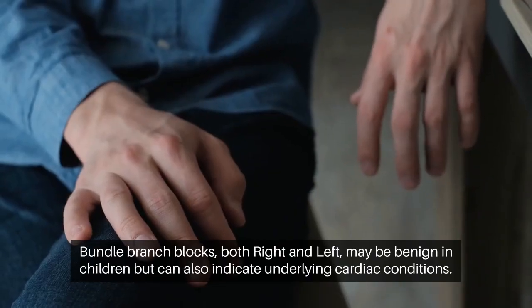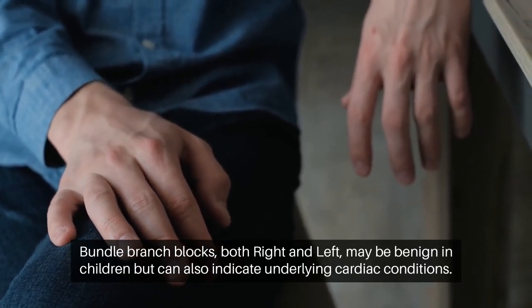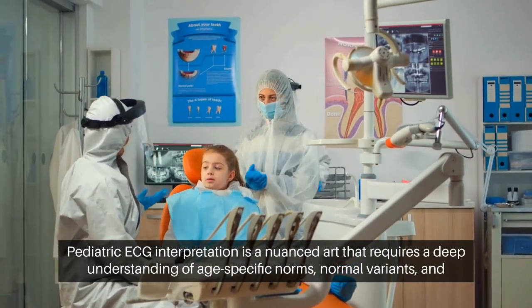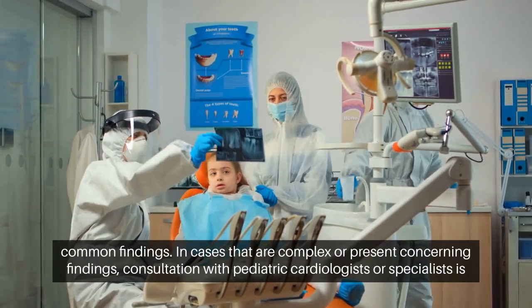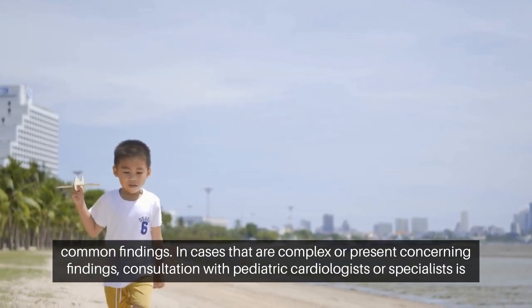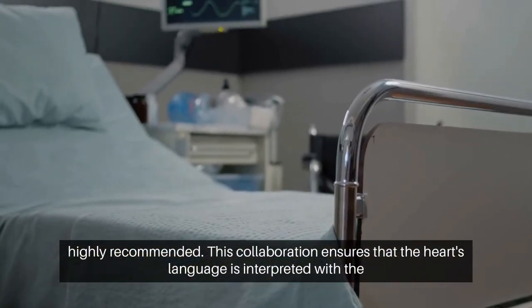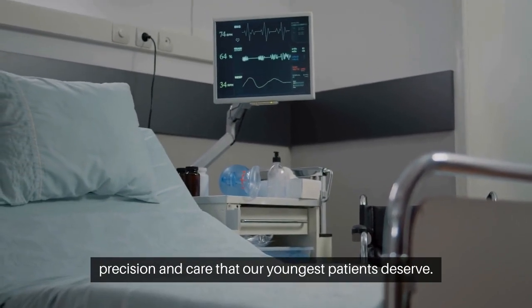Bundle branch blocks, both right and left, may be benign in children, but can also indicate underlying cardiac conditions. Pediatric ECG interpretation is a nuanced art that requires a deep understanding of age-specific norms, normal variants, and common findings. In cases that are complex or present concerning findings, consultation with pediatric cardiologists or specialists is highly recommended. This collaboration ensures that the heart's language is interpreted with the precision and care that our youngest patients deserve.